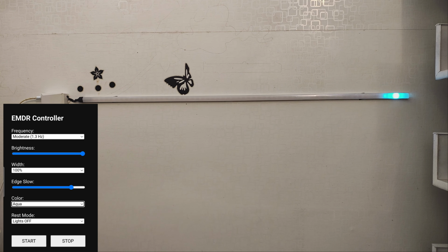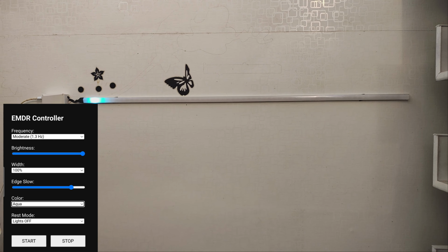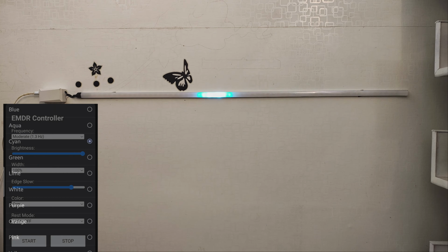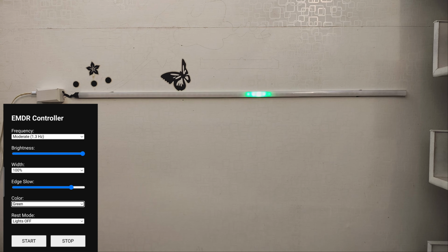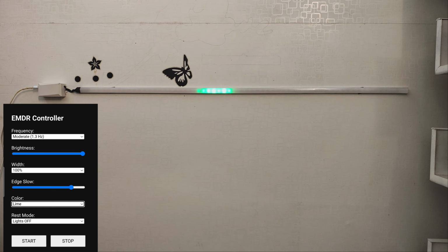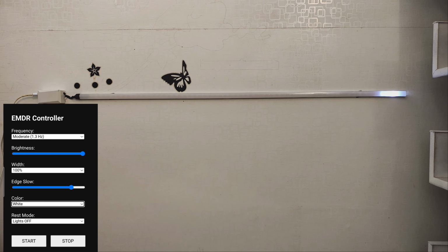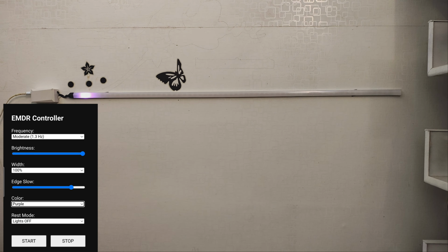I can change the colors as well. I can use colors in the blue spectrum for long sessions, trauma processing, calming, and low eye fatigue. I can change it to green for grounding and feeling fresh. I can change it to white if the client wants it.